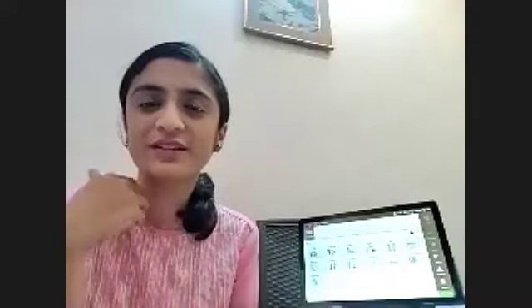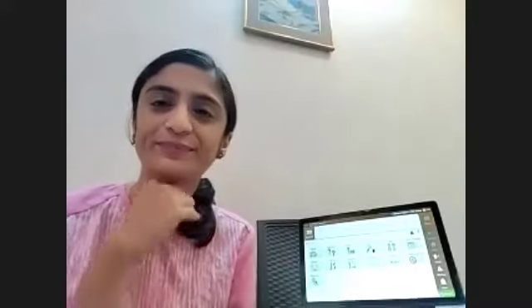I was just saying that you should have more things in the advanced folder to begin with. So you can just continue to use those. And if you can't find them, they should be under core words or basic. So you don't need much preparation. Once you've decided what words you're going to model, then you can just set that up. But mostly you should have everything ready to go.